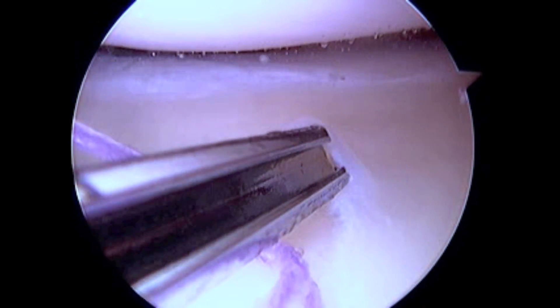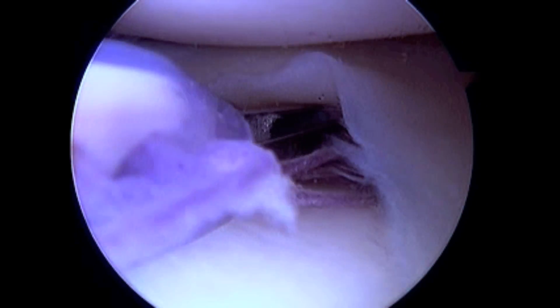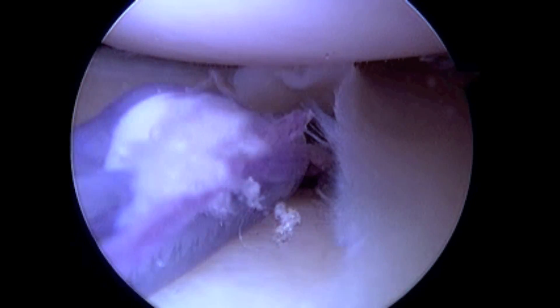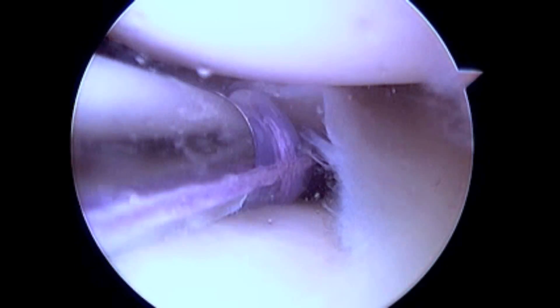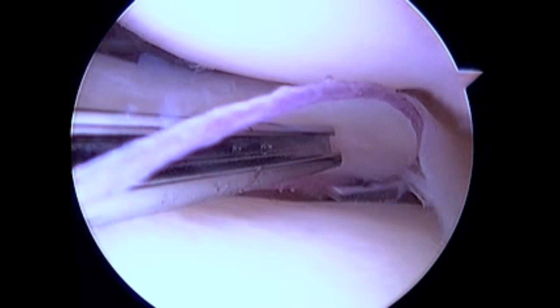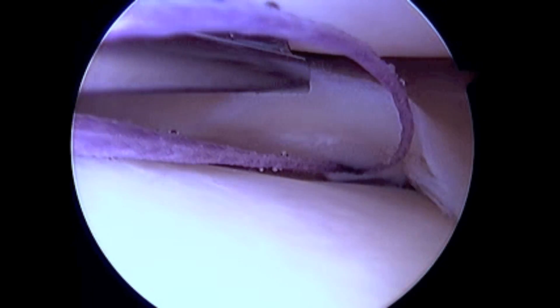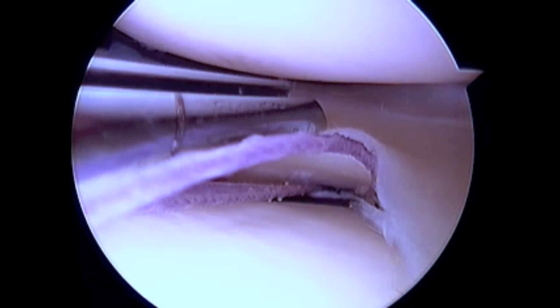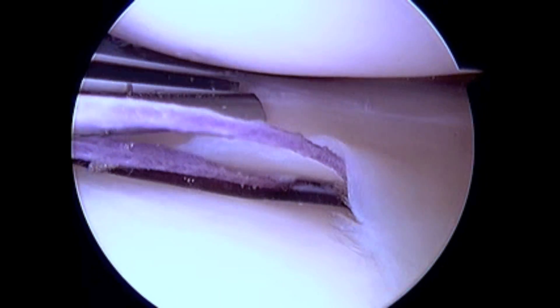As demonstrated here, I prefer to use an all-inside meniscal repair system with a low profile needle and two preloaded peak backstop anchors. During placement of the peak backstop anchors, great care is taken to only penetrate the menisco capsular structures. It is essential to avoid overpenetration and possible injury to the neurovascular structures in the posterior and lateral aspects of the knee.